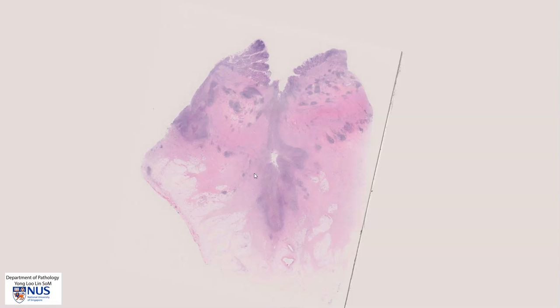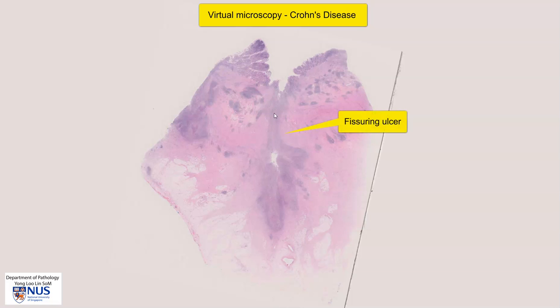Hello, this is a virtual microscopy slide taken from a case of Crohn's disease, and this is the right colon. We can see here very clearly that there is an extremely deep and narrow ulcer that penetrates very deeply into the wall of the colon.